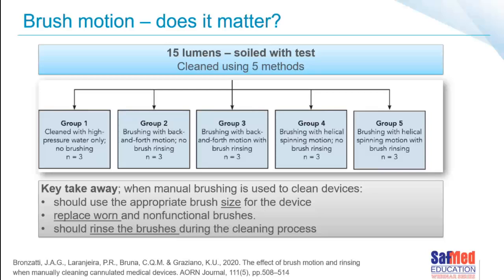Ultimately, the key takeaways from this published paper: the author stated that when manually cleaning our devices with a brush, we should always use the appropriate size brush for the device. That, of course, makes sense. To replace worn and non-functional brushes, and the importance of rinsing the brush during the cleaning process. Those were the key takeaways from that particular research.